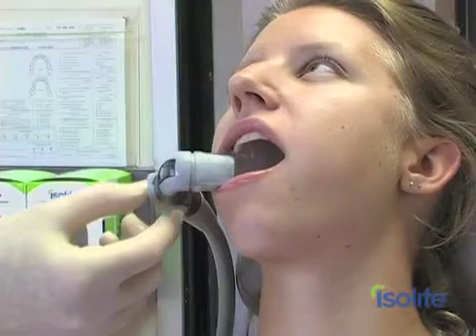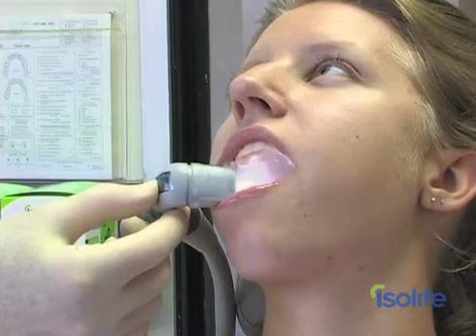Hi, I'm Dr. Thomas Hirsch. I'm the founder and CEO of Isolite Systems, and I'm here today to introduce you to your new Isolite system. It's a system that is a more efficient way of doing dentistry — one that makes it easier, more productive, and better for your entire dental team.